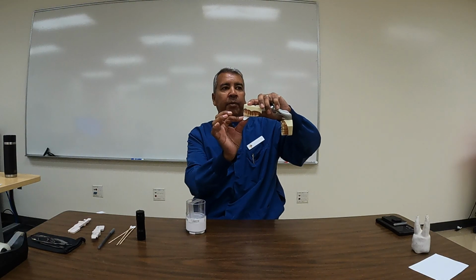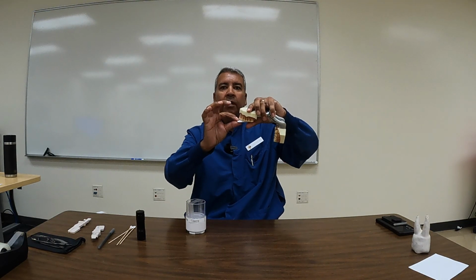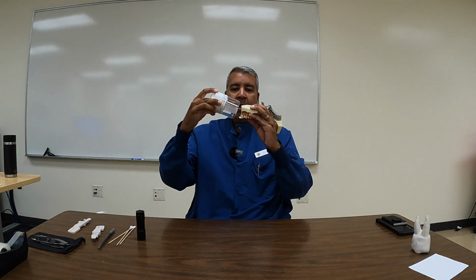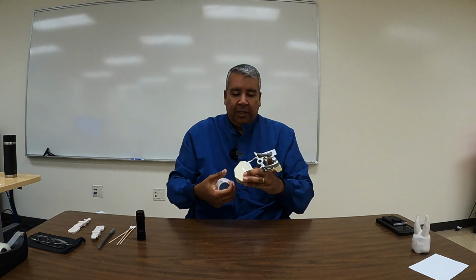Some patients have a very shallow palate, so this will not be deep up into the palate. It'll be more flattened out. Other patients have something called tori, a bony structure on the palate. Torus is actually what it is. Torus for the maxillary, and that will be kind of like this, a bony structure. They might have it on the bottom too. It's called tori if it's on the bottom. Some of you may even have this and didn't know you had it. It's just an extra amount of bone that will change the angle of this film. So instead of the bisector being at this angle, it is now at this angle. It doesn't matter how it looks, as long as you know where the bisector is, that's how it has to be when you take it.